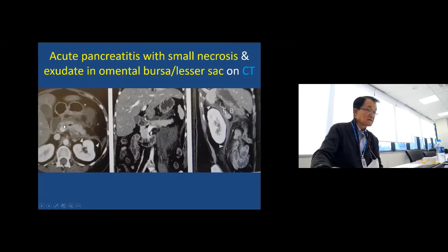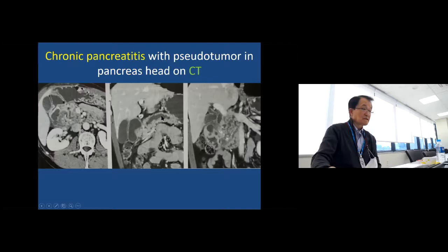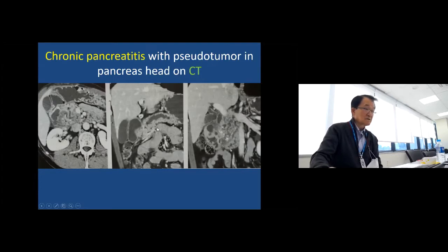Pancreas here, and some small low density could be small necrosis. It is more likely pancreatitis, which makes an edematous, swollen pancreas. And maybe some surrounding small lymph nodes, but it's more likely small necrosis. With haziness, usually we see some little lobulation; normal fatty density we don't see because of edema. So this is dilatation of the pancreatic duct because it's obstructed at the proximal portion. The head of the pancreas is all swollen. It's almost like a pseudo tumor obstructing here, but this is chronic pancreatitis. By this imaging, you cannot rule out a small tumor blocking here.